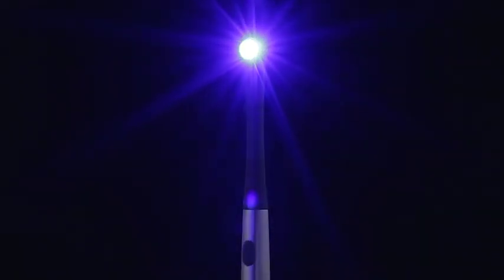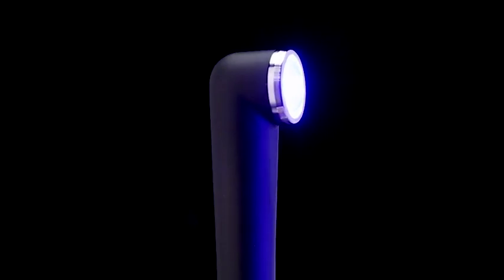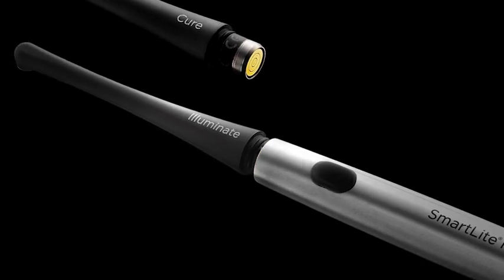One press of the button delivers a powerful 10-second beam that completely cures most Dentsply Sirona restoratives with no guesswork, and the modular design of SmartLight Pro accepts additional tips that can be changed for different clinical indications.